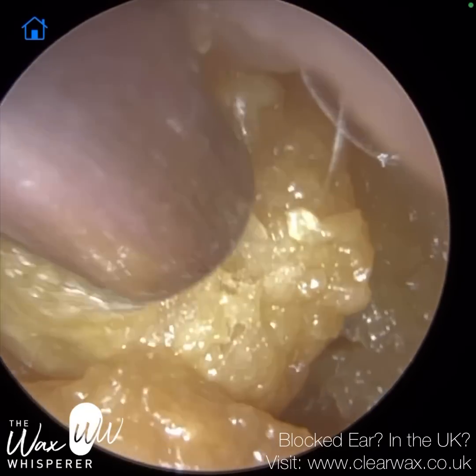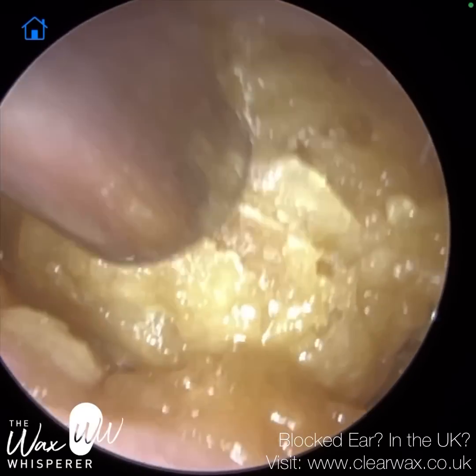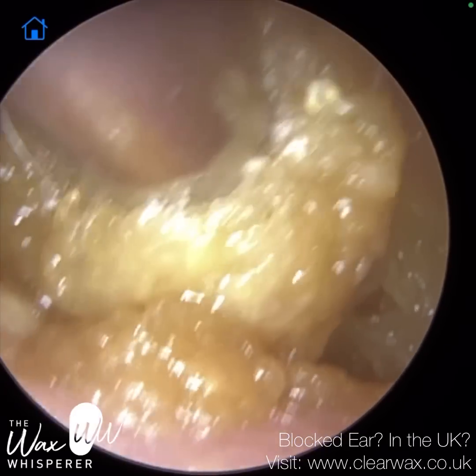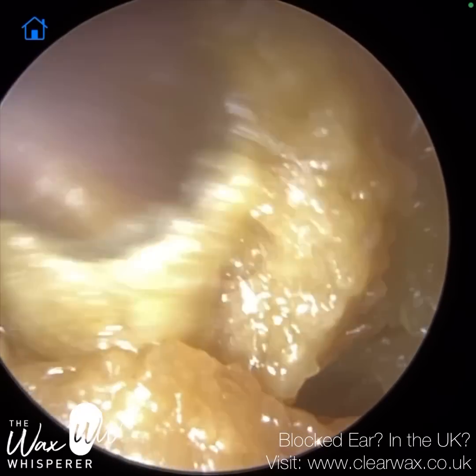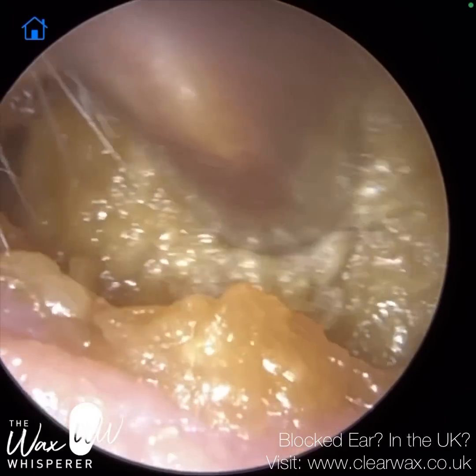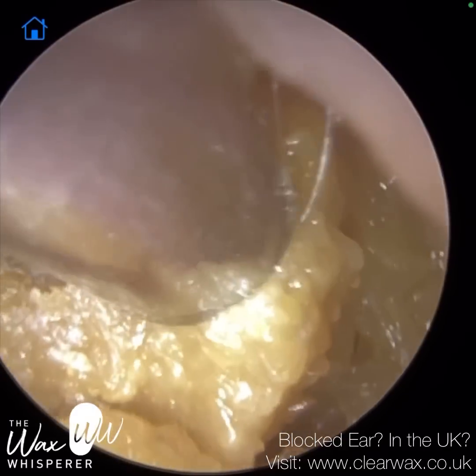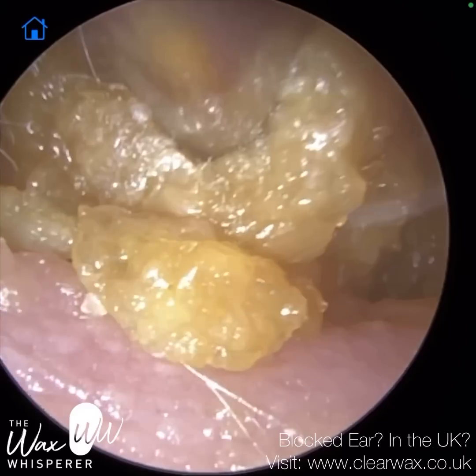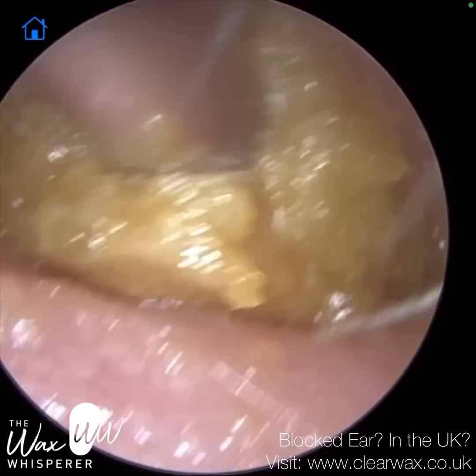As you can see, it's softened the surface of this wax and keratin plug. In their right ear, they didn't use any softening agents, and you will notice the difference in consistency when we come to the right ear — that's a lot drier and firmer, and I had to use an ear hook in the end to extract the large plug of wax and keratin.